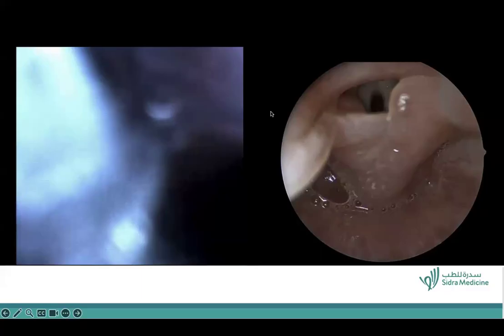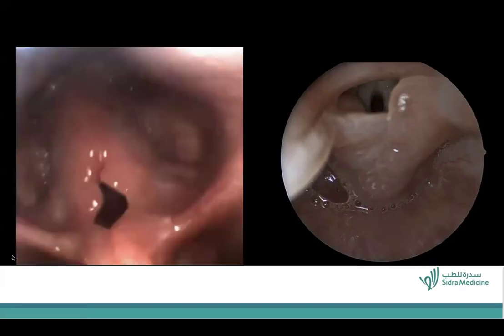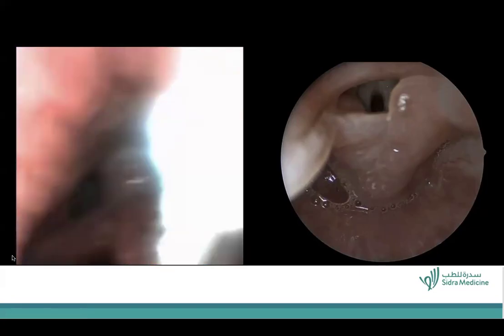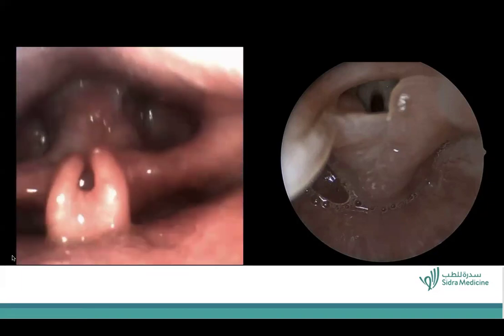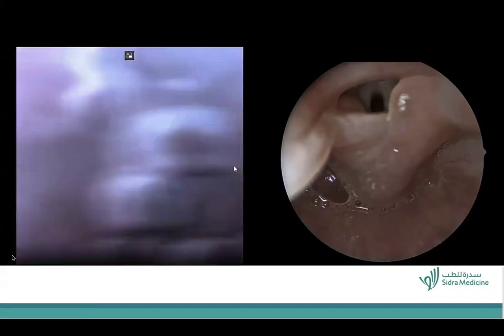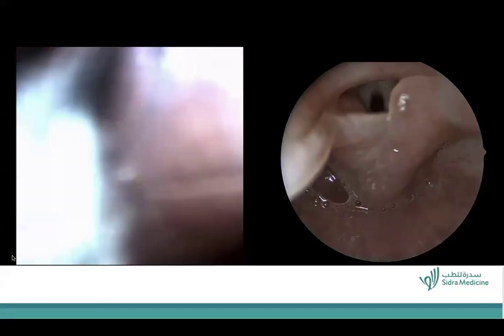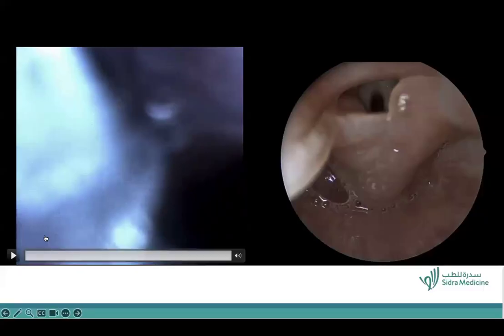Okay, great. I see Priyanshu Shah mentions laryngomalacia. Absolutely, spot on. And with laryngomalacia, as you can see, you have that redundant arytenoid prolapse. As you can see in the glottic area, you can see a bit of redness, and you see tight aryepiglottic folds that are pulling the epiglottis into almost a taco shape, just like that. So those are very typical features of laryngomalacia.